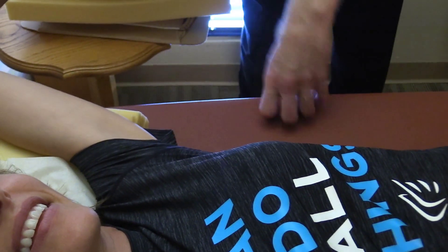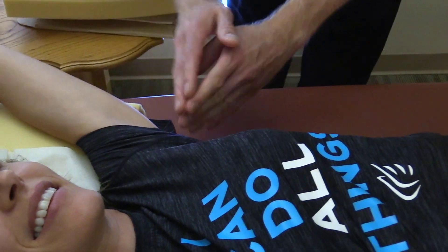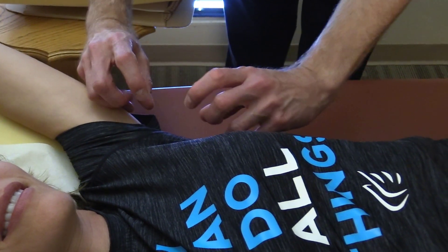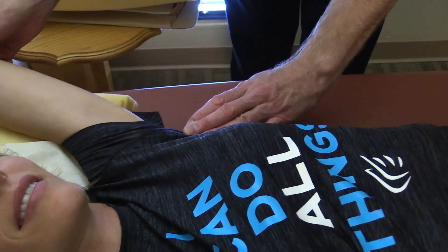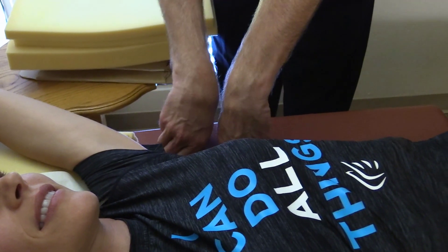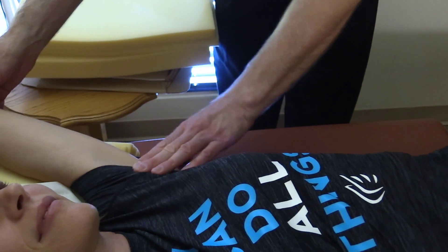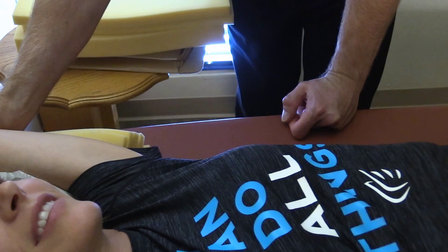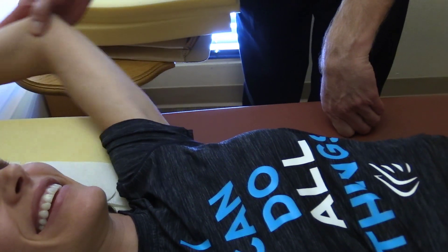When you're stretching out like that, the lasers have to cover more surface area, but they don't have to go as deep because there's less thickness to treat. So it's not only good for evaluating, but it's also a good treatment philosophy: if you can stretch it while you're treating it, have it slightly stretched. Now, I don't need to stand here and hold this for her, nor does she need to take her other arm and pull it over, but it does need to rest there. If the arm kept wanting to fall off, she wouldn't like that at all.